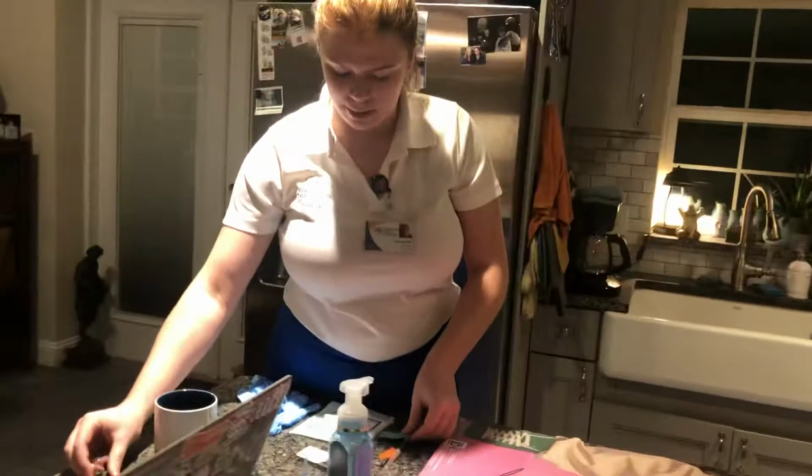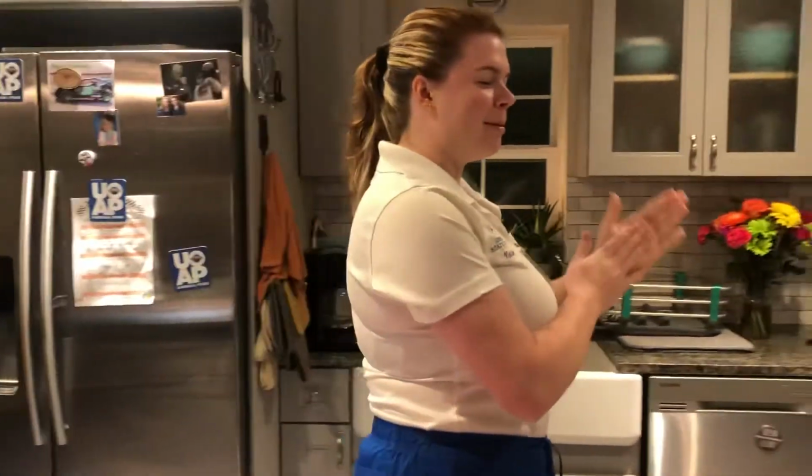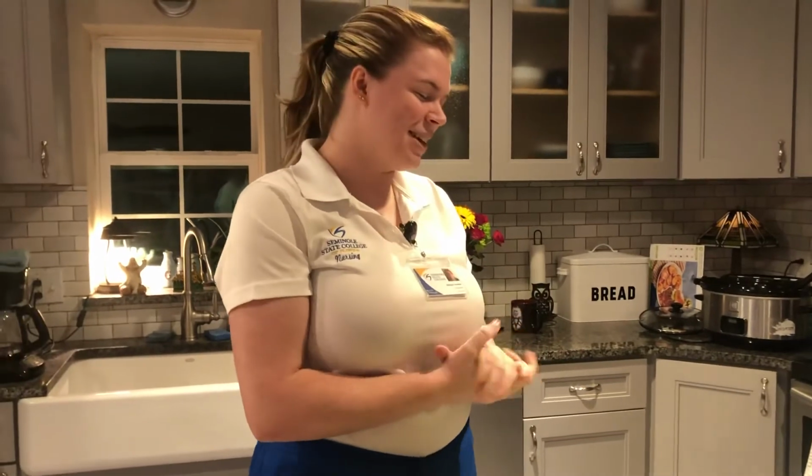So I clean up my area a little bit, and then of course I bring all the stuff I need into my patient's room. Good. Washing my hands. Hello, my name's Abby. I'm going to be your student nurse today. Hello, hi, can you just give me your name and date of birth?